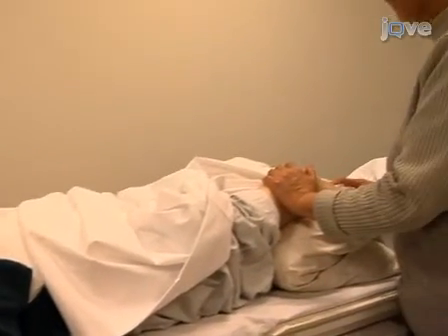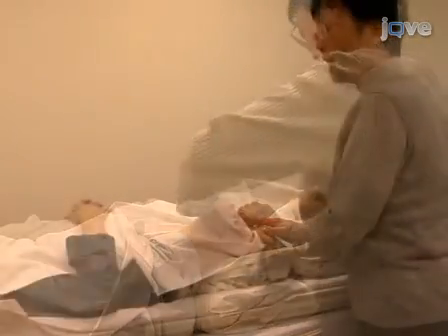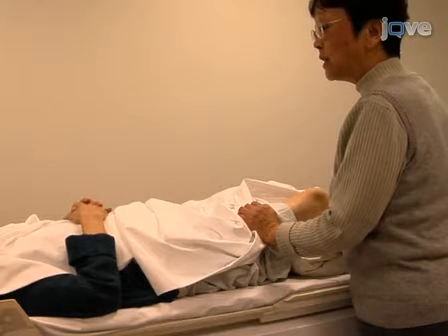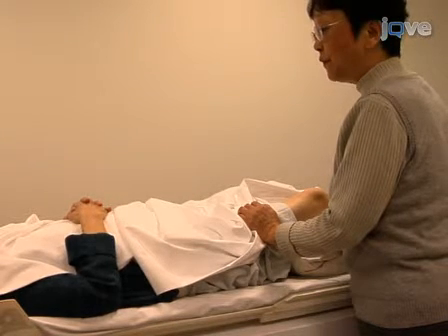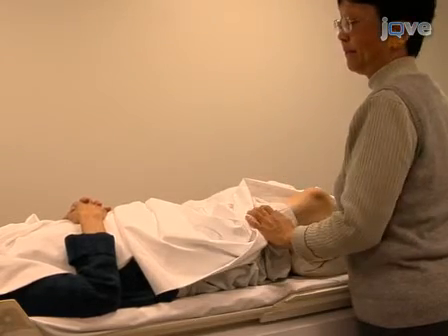Begin by instructing the subject to relax, keep their eyes closed, and refrain from moving during the scanning. To avoid noxious stimulation, instruct the subject to raise one finger if any of the acupuncture sensations approaches a pain rating score of 8 out of 10, and to raise 2 fingers in case of any degree of sharp pain.